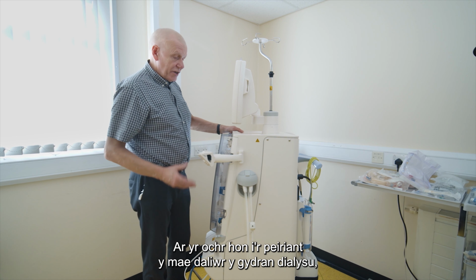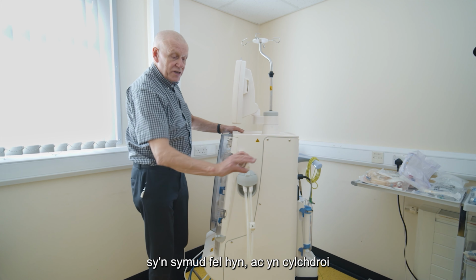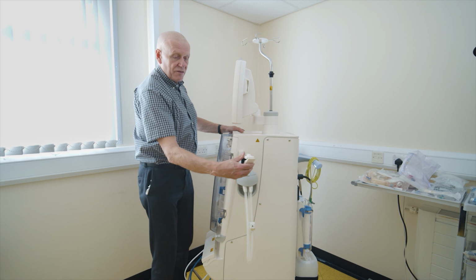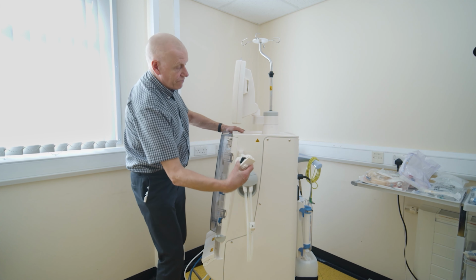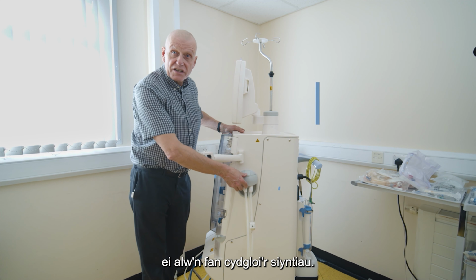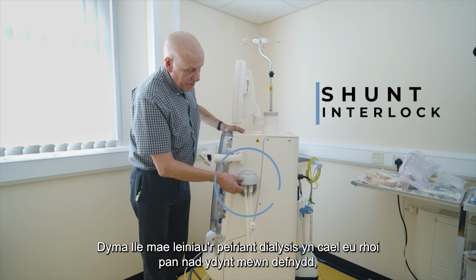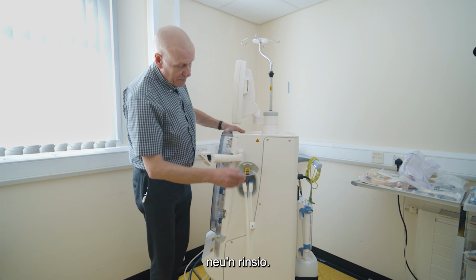On this side of the machine, you have the dialyzer holder, which moves like that, and that rotates through 360 degrees. You then have what we call the shunt interlock. This is where the dialysis lines sit when they're not in use or when the machine is disinfecting or rinsing.